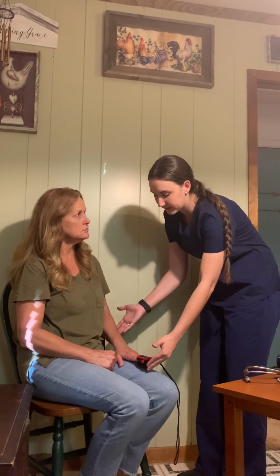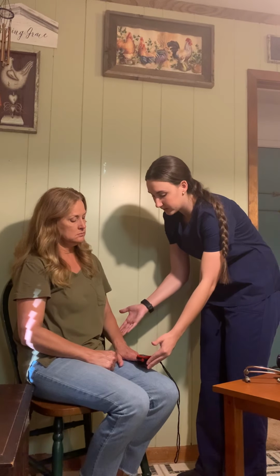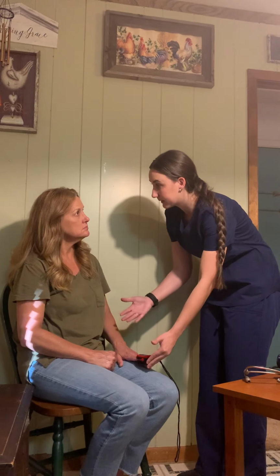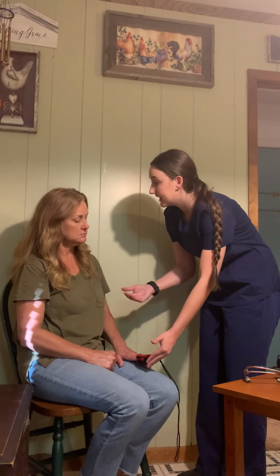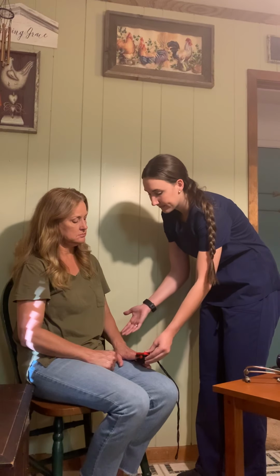While we wait, I'm going to tell you that oxygen is a good indication of your exercise level. So you don't want your oxygen to be too low, or you're not going to be able to perform those exercises and activities that we were talking about earlier. Okay, so your oxygen level was 97%. Normal ranges for oxygen is anywhere from 95 to 100, so you were good there.